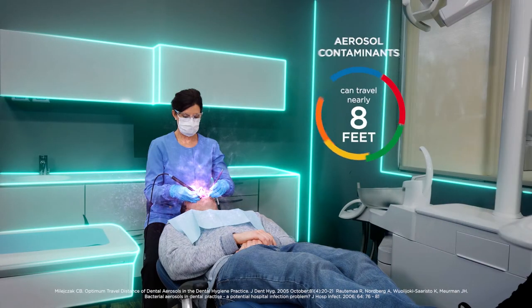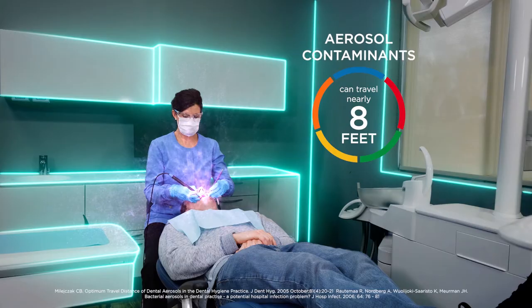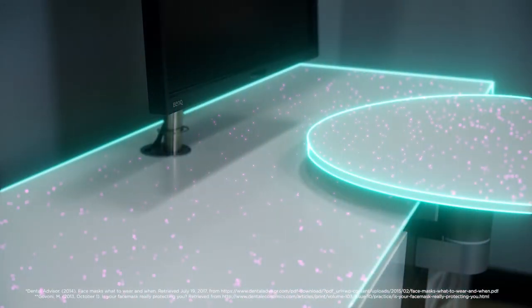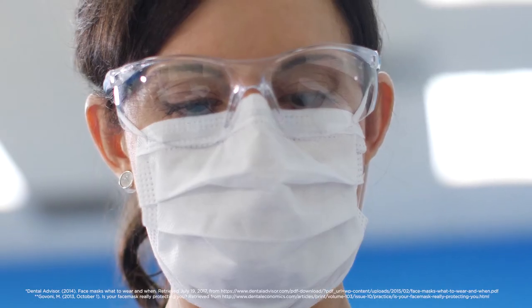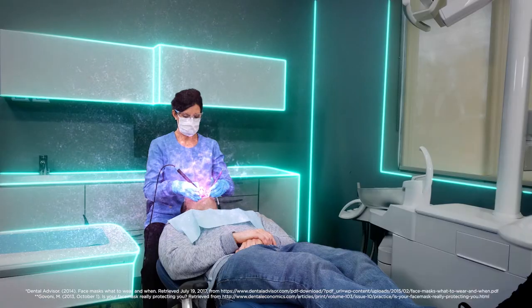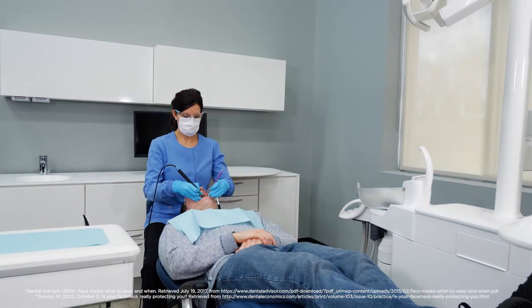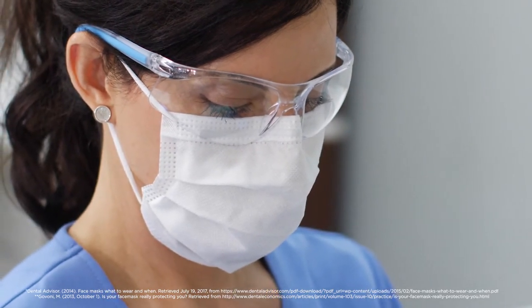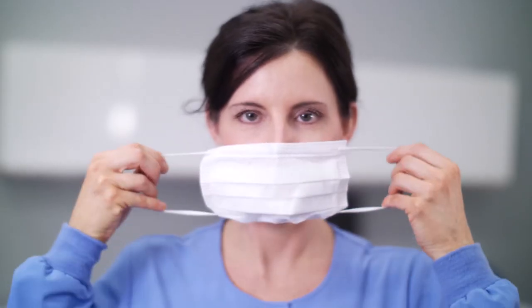Did you know that aerosol contaminants can travel nearly 8 feet? Both the Centers for Disease Control and the Occupational Safety and Health Administration recommend choosing a face mask appropriate for the dental procedure being performed. And yet, many clinicians are not using a face mask that has been rated by the American Society for Testing and Materials, called ASTM. Comfit Plush Natural Fit and Comfit Plush Face Masks have the ASTM rating that make it easy to choose the right level of protection every time.